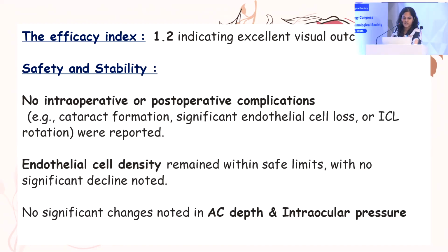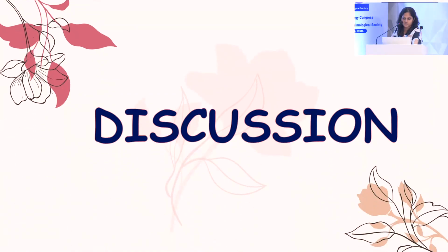Regarding the safety and stability, in this study there were no intraoperative or postoperative complications. Endothelial cell density remained within safe limits with no significant decline. There were no significant changes noted in the anterior chamber depth and intraocular pressure.